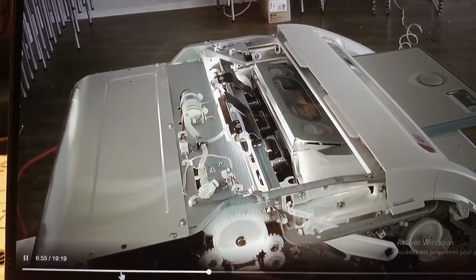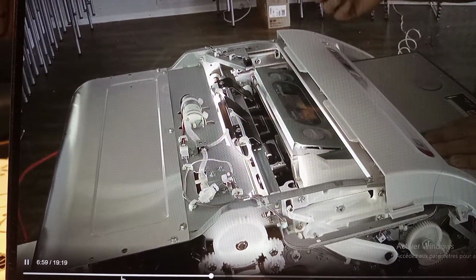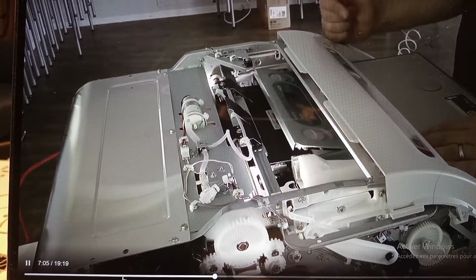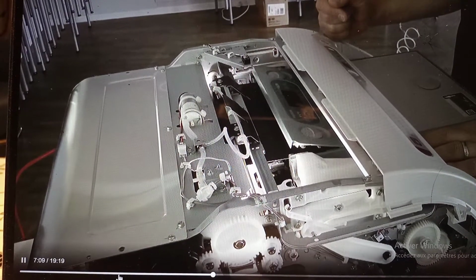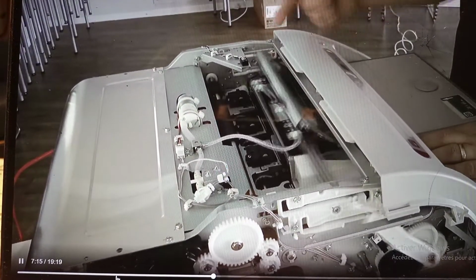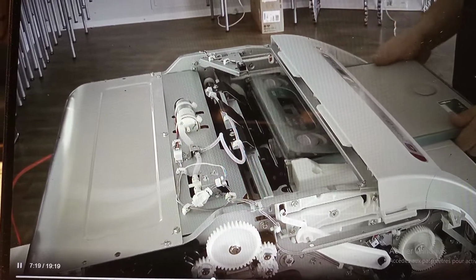When the readout process is done, the image plate will be pulled back in the cassette, and during this it will pass by the erasure lamps to be erased. Now the image plate will be put back in the cassette, and the process is finished.